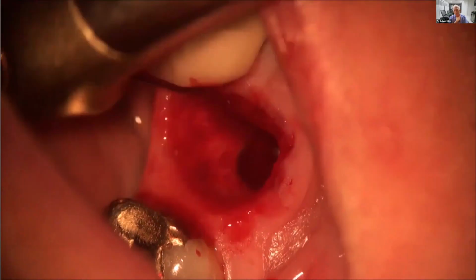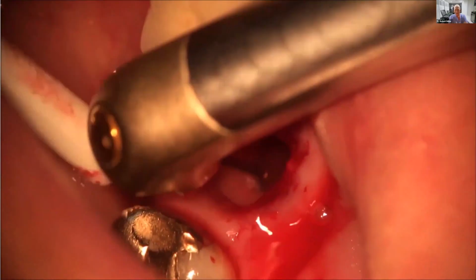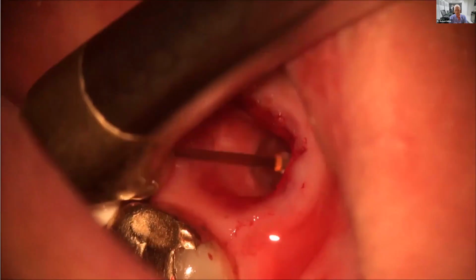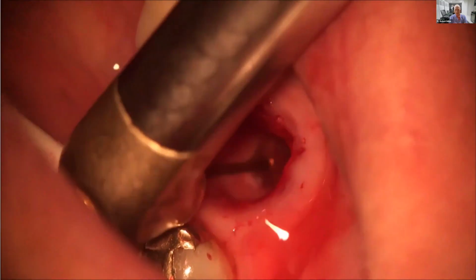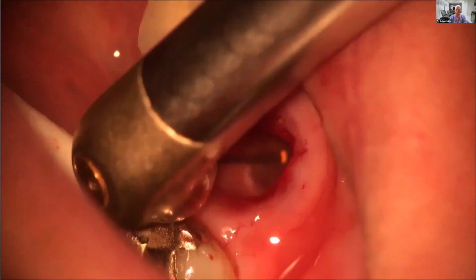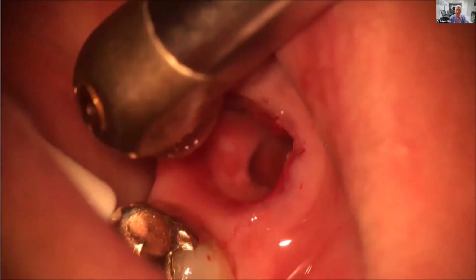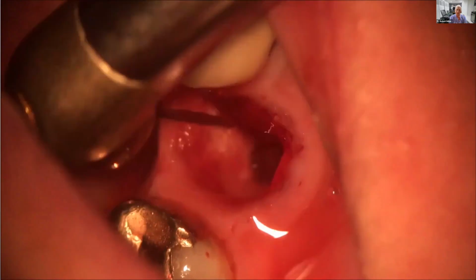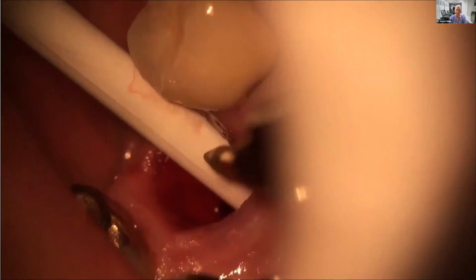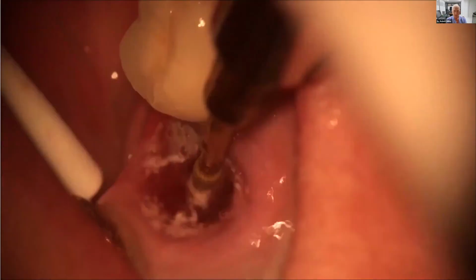I love lasers. This happens to be the BioLase I+, which I've been using since 1997, an outstanding instrument for the final debridement. But note, when I'm cleaning this out, look at the condition of the bone. You don't see medullary spaces here. It's dense cortical bone. And it won't bleed. So therefore, we must decorticate this.